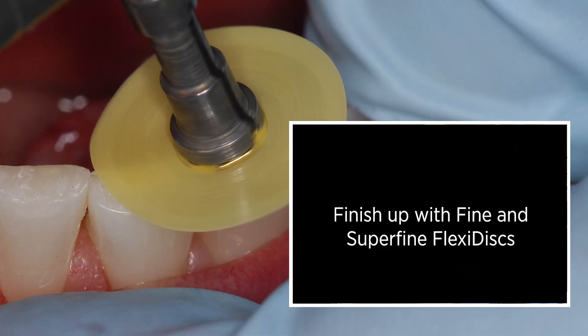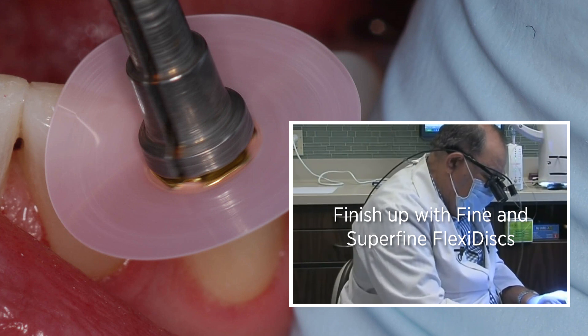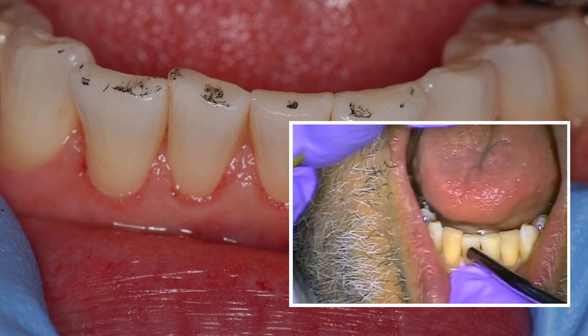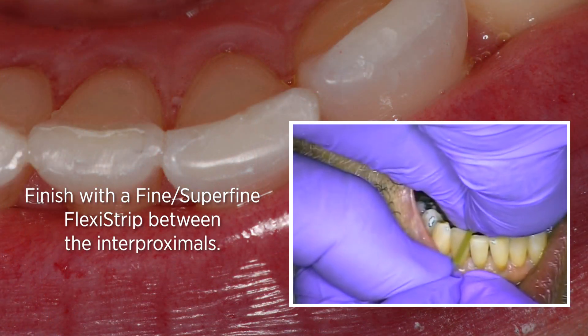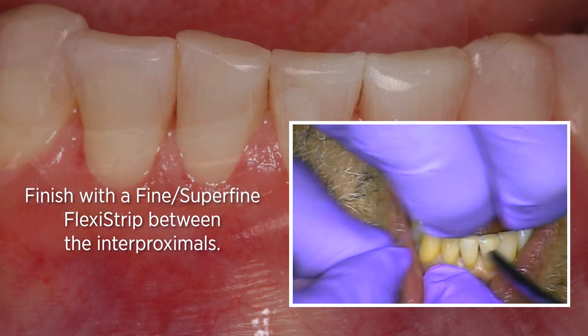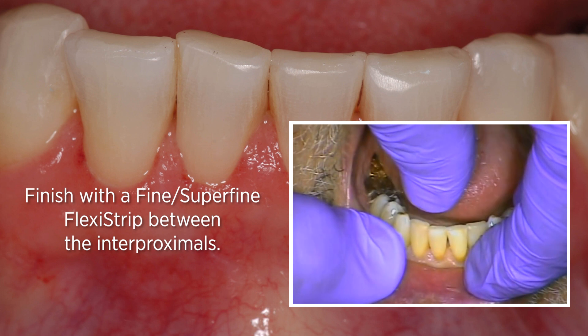All I'm doing is finishing the proximal surfaces. I started with a diamond strip, and now we're finishing with a fine, super-fine aluminum oxide strip in the interproximals — just making them as smooth as we possibly can so it's comfortable for the patient.